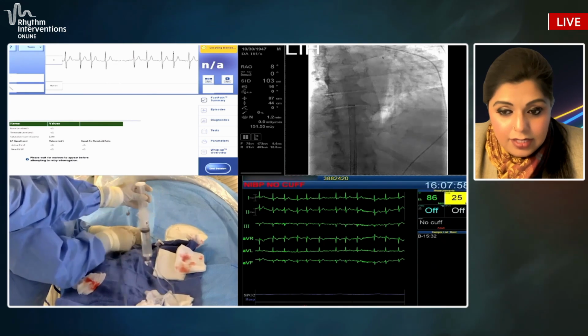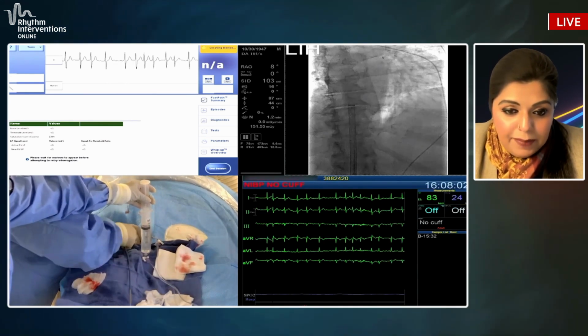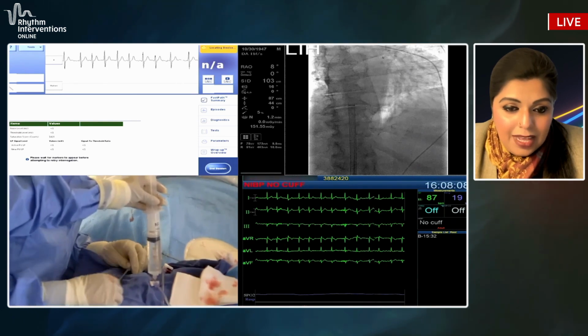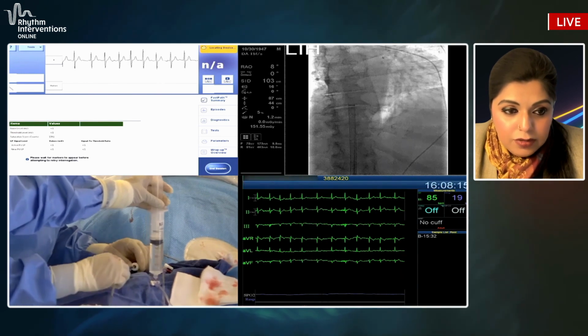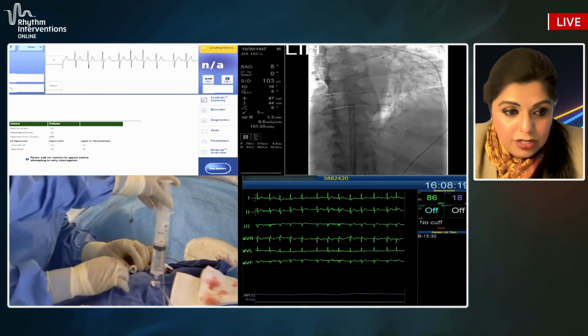You can see the syringe is open to the tool. To insert the valve bypass tool, you align the tabs and take a quarter turn and lock it in place. In that way, it stays in place and you keep that syringe port open. And as I'm moving the delivery system, you'll see the saline going in, so it prevents any kind of air entry.